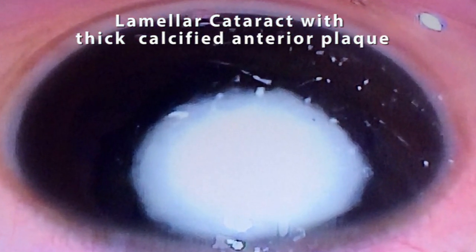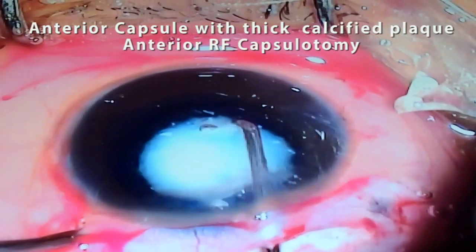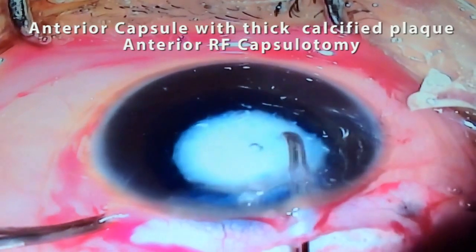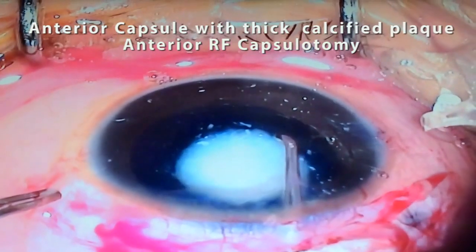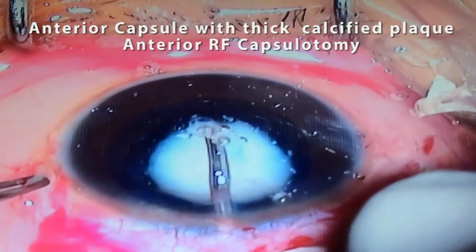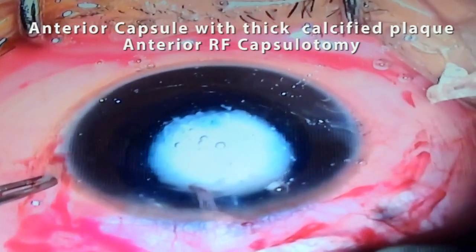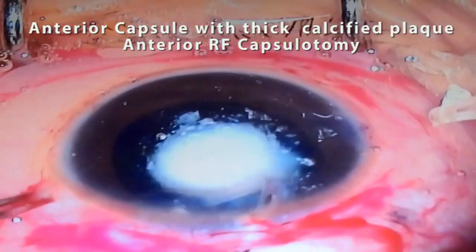In situations such as pediatric cataract with thick calcified plaque, surgeons face extreme difficulty in making manual capsulorhexis with fear of rhexis radial extension. In this scenario, RF diathermy comes in handy and also eliminates the need for capsular staining.